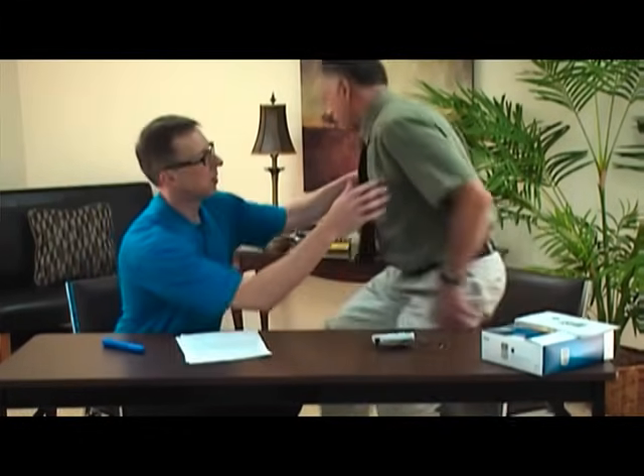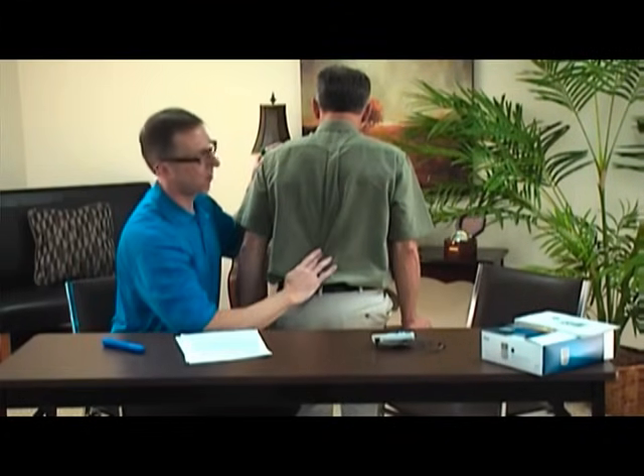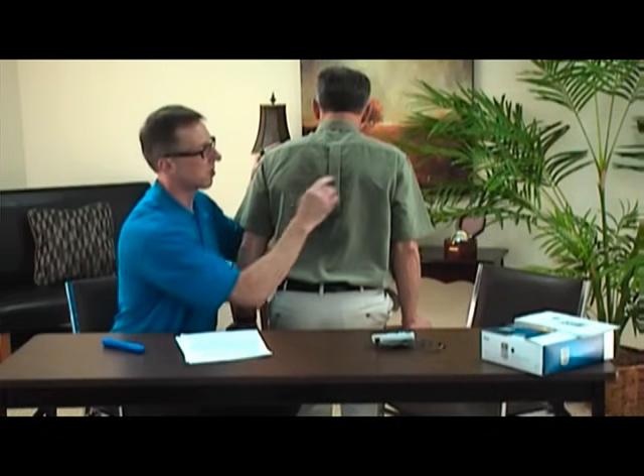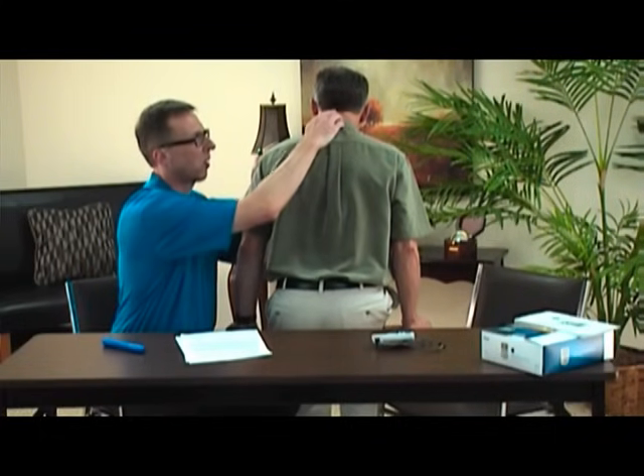A very popular area is also to use it on the neck and back. But not directly on the spine. The spine runs right along here — that's the actual spine. But you can certainly use it on the muscles around the spine, and that's where you should be using it. Not directly on the spine or on the neck. You can use it on the muscles around the neck.